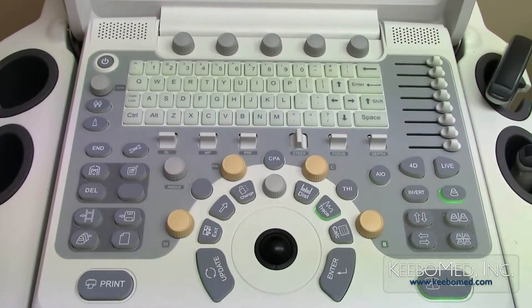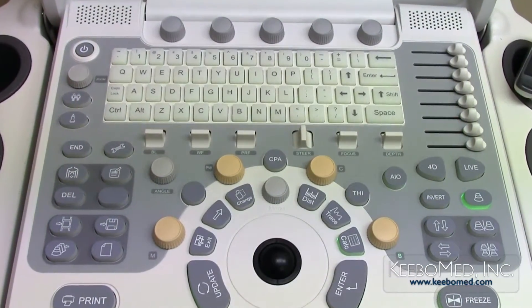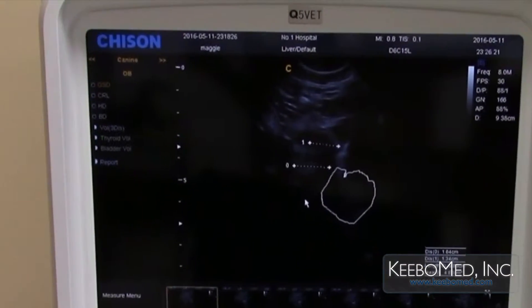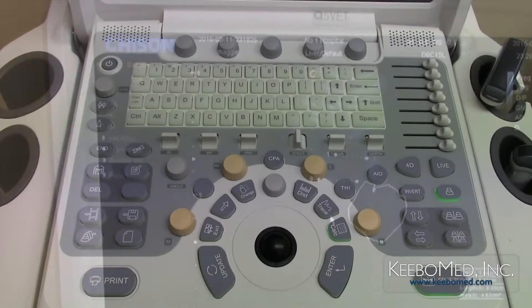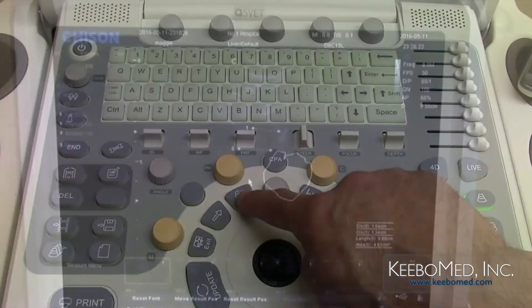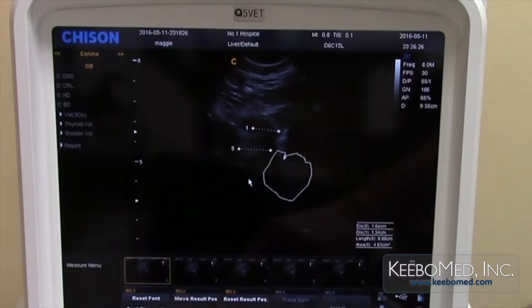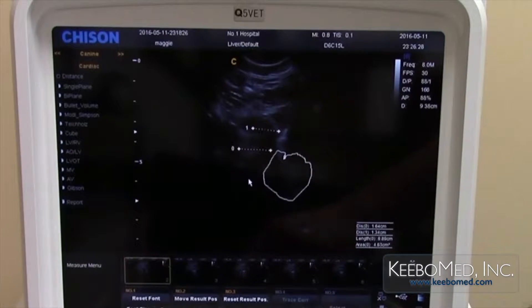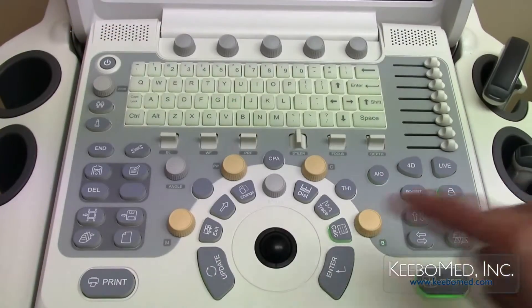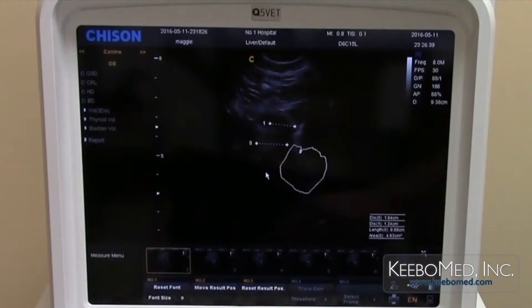Pressing the calculation button brings up a menu on the top left of the screen that shows the different calculation options available for different applications. Press the change button to select different applications. Press the exit key to exit out of the calculation menu.